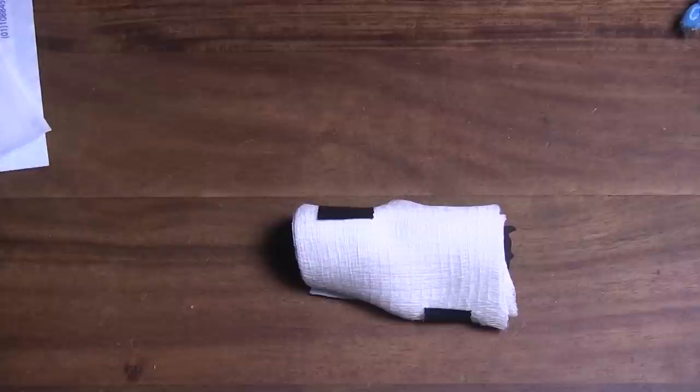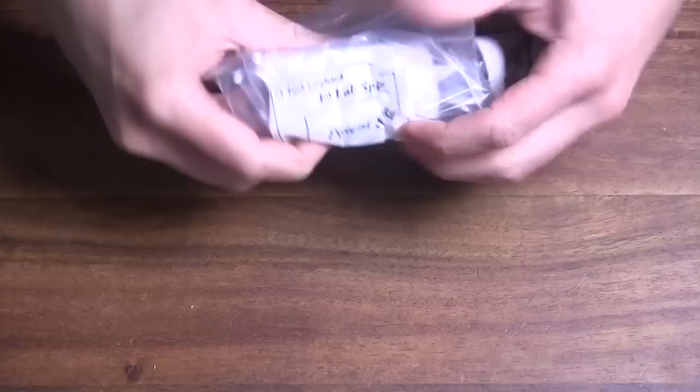Last thing you need is a plastic bag. The specimen bags, of course, we wouldn't steal this from the actual hospital, but the specimen bags that you might or might not have at your hospital or any kind of plastic bag is fine. We'll simulate your skin quite nicely. And you just put it in there and fold it on up.